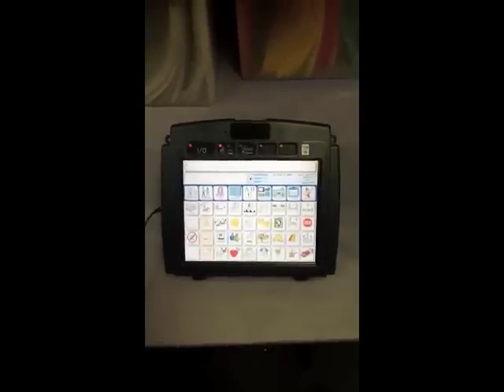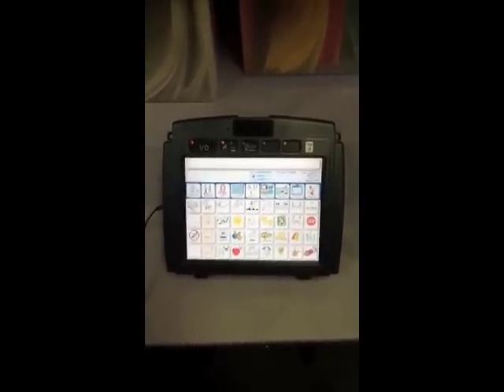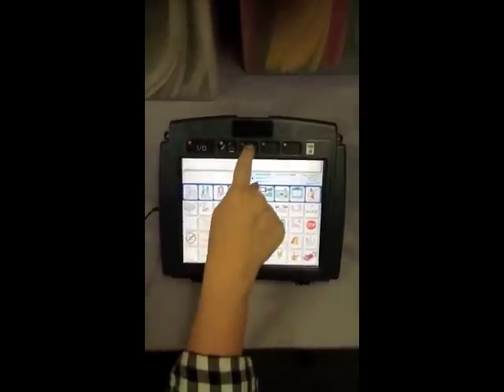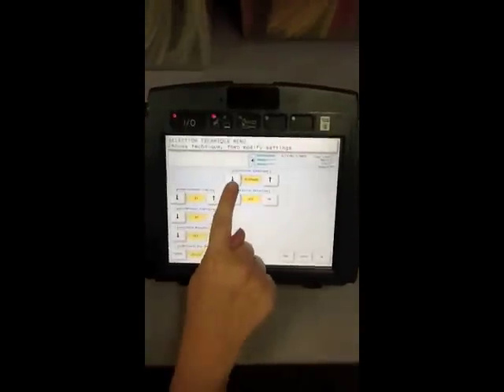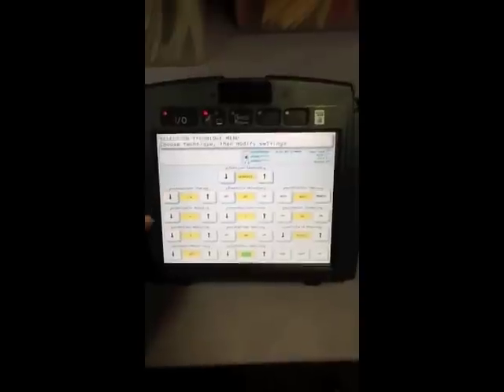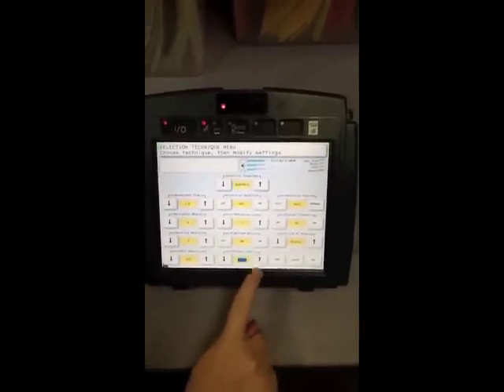There can be many changes made to the access method of head pointing. To get here and make these changes, you go to the toolbox and you click on the Selection Technique menu and you go to head pointing. Here you can change the acceptance time, the horizontal and vertical adjustments, and the pointer color and other options for head pointing.